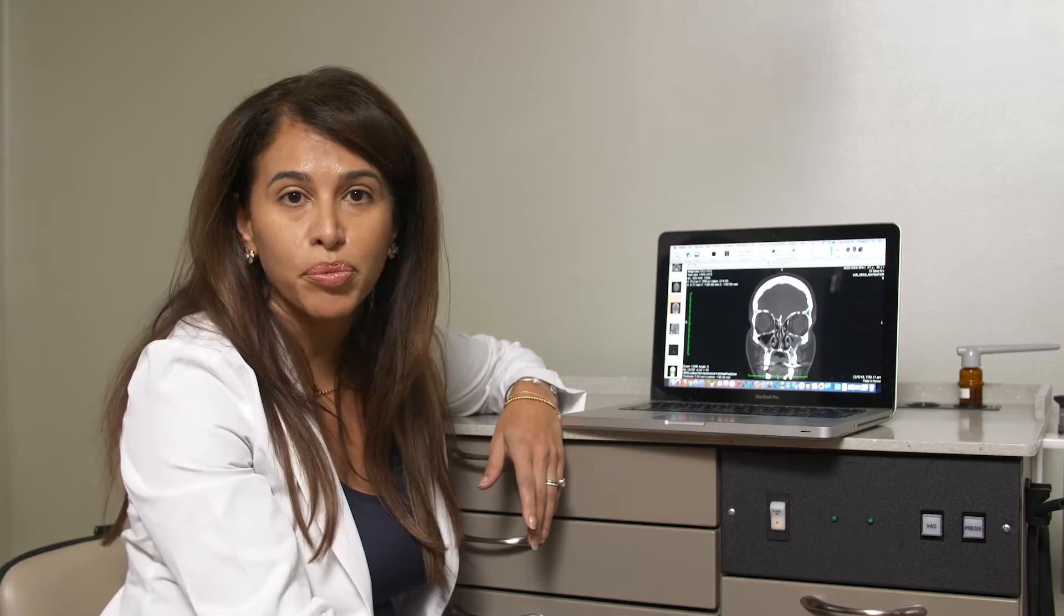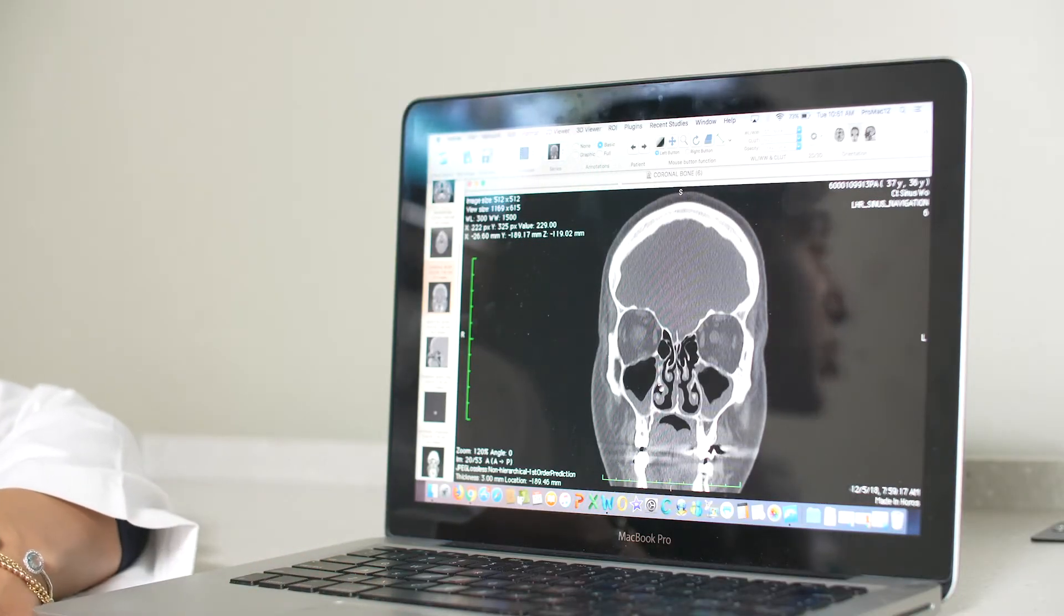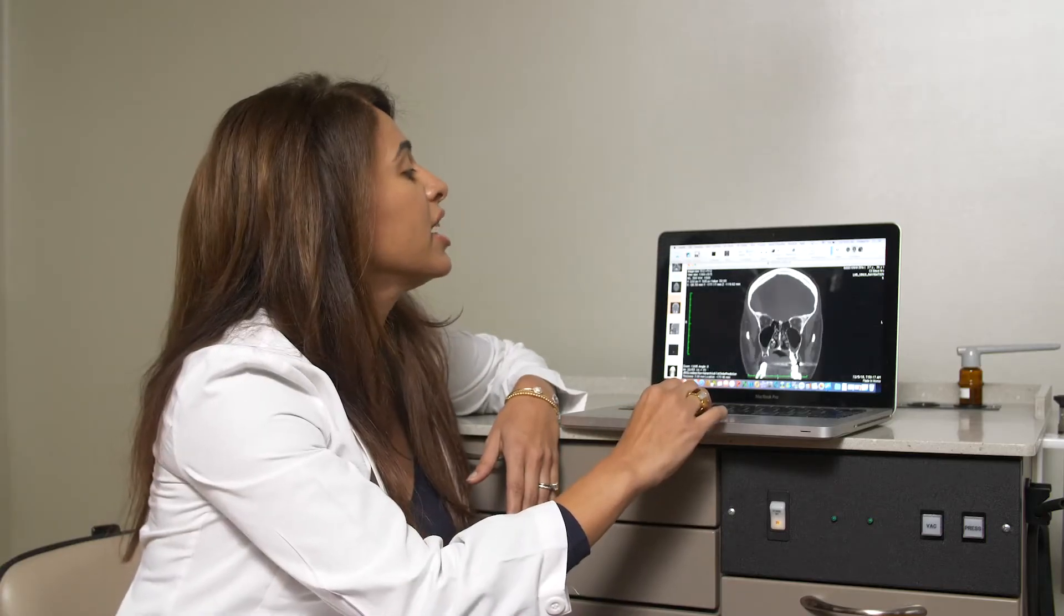When we're born, our sinuses are underdeveloped. Our heads are small. Little air cells start to develop as our heads grow, and that develops our sinuses. But when you look really close, everyone's sinuses are just a little bit different.